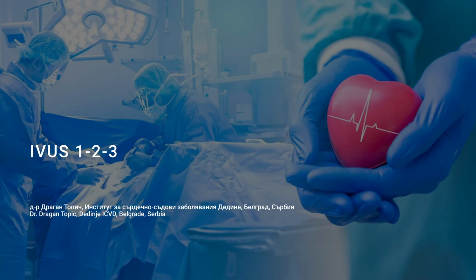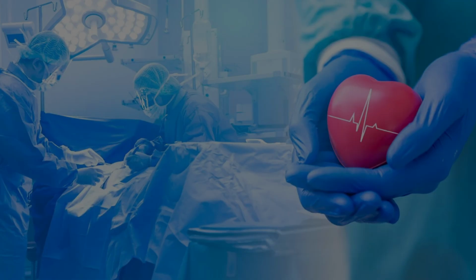I'm coming from the Institute for Cardiovascular Diseases, Dedinje, and I will say a few words about intravascular ultrasound. As we all know, intravascular ultrasound represents the first imaging technique in interventional cardiology. With its excellent image quality and spatial resolution, IVUS has for more than 2 decades provided complementary diagnostic information to coronary angiography regarding the dimensions, structure, and lumen of the blood vessel.